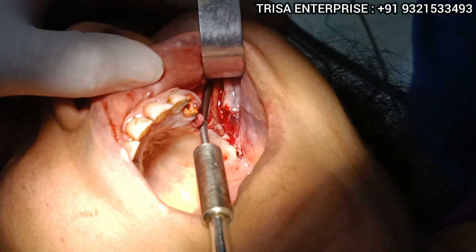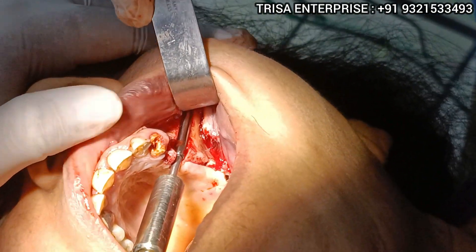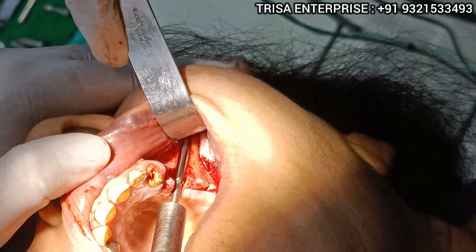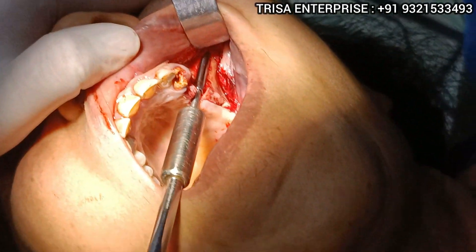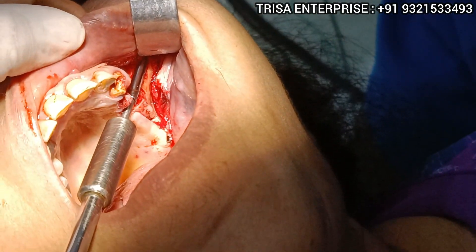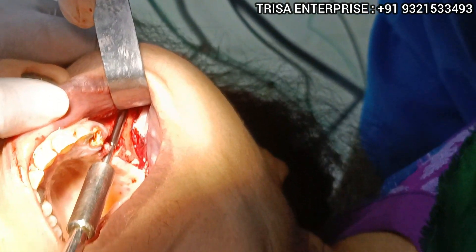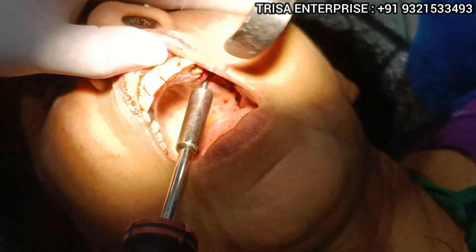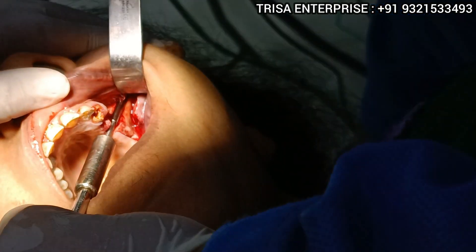You can either use the driver or you can use the hand grip. I have started to get very nice torque — almost like an infinity torque. It is all locked.